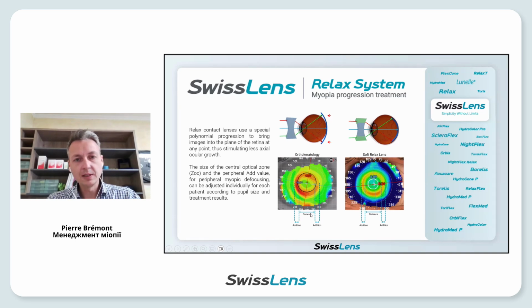The distance in the middle is the size of the optical zone in the center. And the value of the defocus, the red part, the ring around, is the defocus on the retina. If the defocus is higher, the red part is more red, and there is more difference between the mid-periphery and the center of the retina.